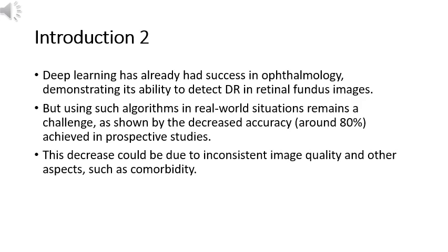We can find similar outcomes with the detection of referable AMD. 18 However, using such algorithms in real-world situations remains a challenge, as shown by the decreased accuracy, around 80%, achieved in prospective studies. 19 This decrease could be due to inconsistent image quality and other aspects, such as comorbidity.